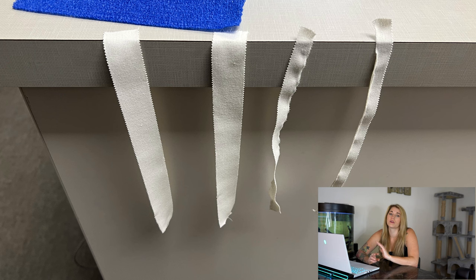You want to have your t-port ready and flushed. I like to put a t-port on every catheter unless the patient is there for euthanasia, just because it's great to have the extra access rather than just having a port on the hub of your catheter. You want to have your tape and/or vet wrap ready so that you can quickly secure your catheter. I like to have two wide pieces and two skinny pieces.